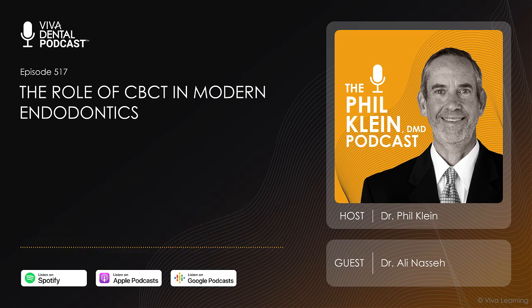to a whole next level. So the AI, I predict, is going to come in and be able to interpret the image, find the pathology ahead of time, and give us guidance and suggestions in terms of having far better access to the raw data that we're getting out of the CBCTs, in its most optimized form of manipulation, showing where the pitfalls and difficulties are in the canal, how many canals there are, how it should be addressed, and what the potential areas are that you should be careful about.